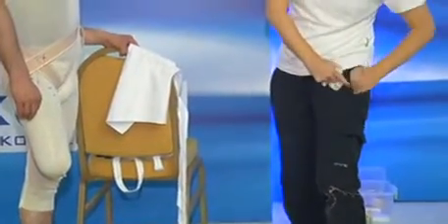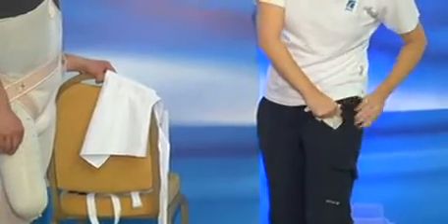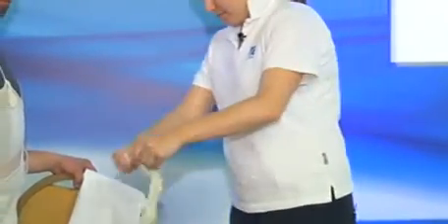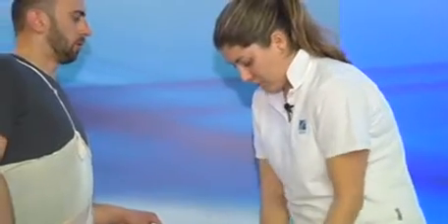The other slab I've made is one to go on the lateral side to get a good covering of that, as well as, hopefully, going around the distal end as well.